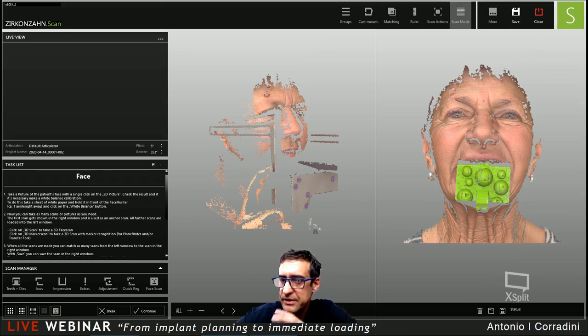And also that the scan with the face hunter is really stable. So if you take a patient and you scan 5 times in the same position and you have a look at the dimensions, they are really stable and quite similar, the same, let's say. If you take a look at a face scan that you did with a different system or by the phone, you do not have this reproducible dimension, let's say. So this is really important.